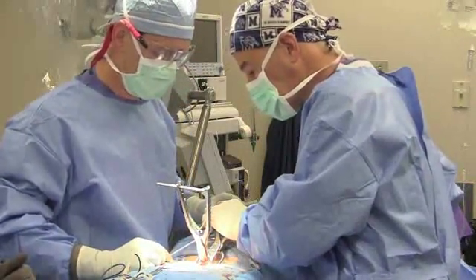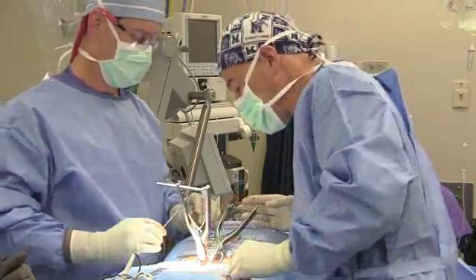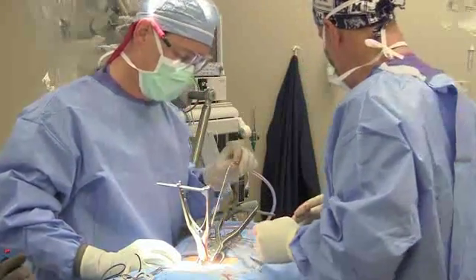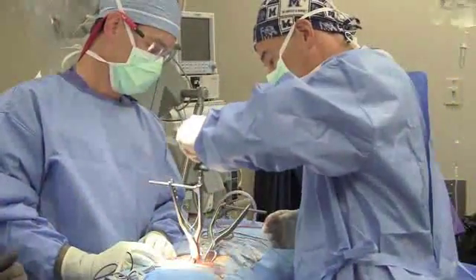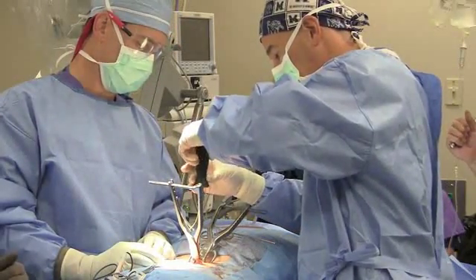Once we've done that and we're sure that we're in good position, we'll use a small screwdriver to turn the torque screw in the device, and this locks the device in place. Once we've done this, we can also place more bone graft behind the device, which adds to our fusion.